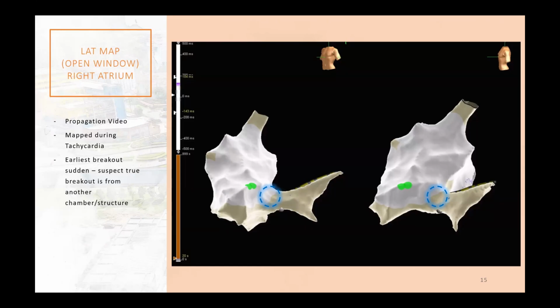Without a venogram, you will not know. So if you occlude the vein, your impedance is going to go sky high. That's what you're talking about. Right. You cannot burn. But that is not safe enough. So you really have to see the physical dimension of the MCV, and MCVs are sometimes very big. You need to know whether your pathway is at the medial aspect or lateral aspect of the MCV, and so on. So you really have to map. It's not just a slam dunk thing.